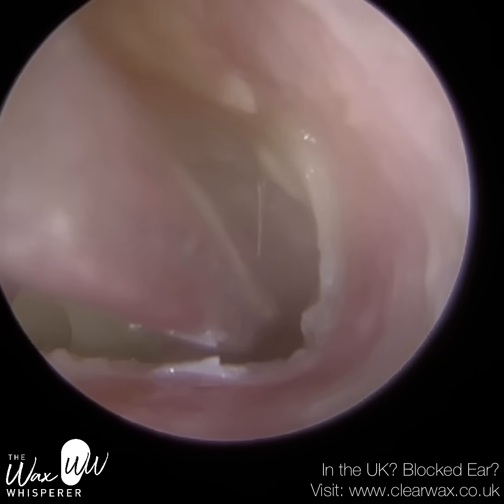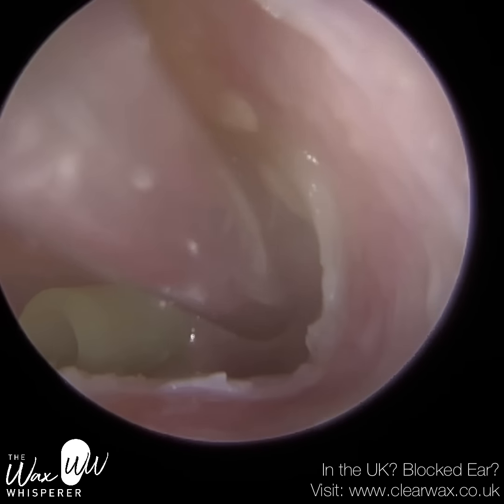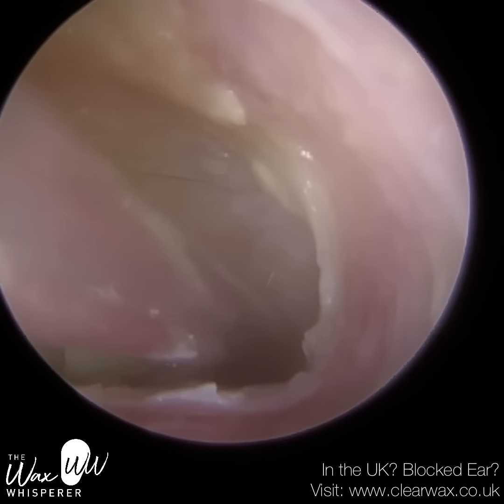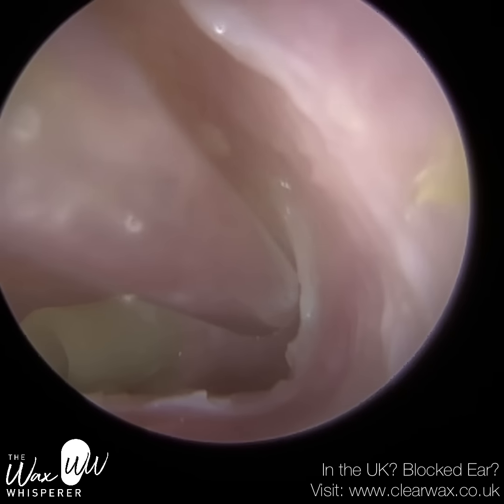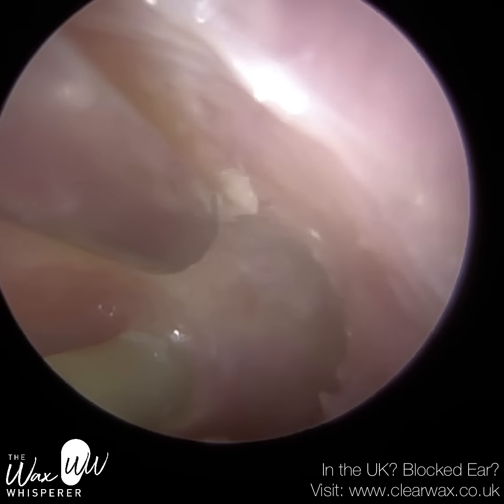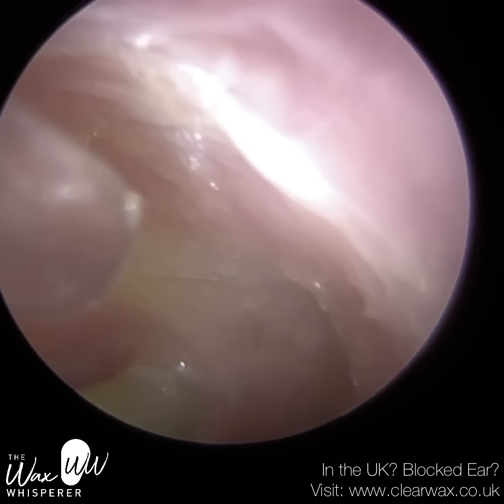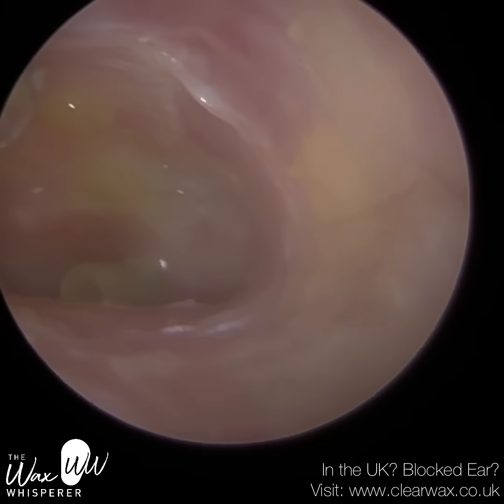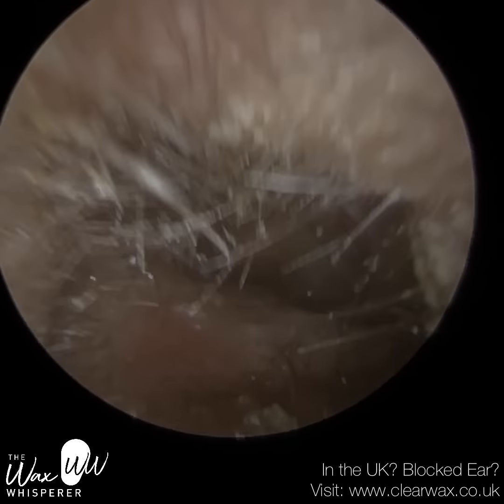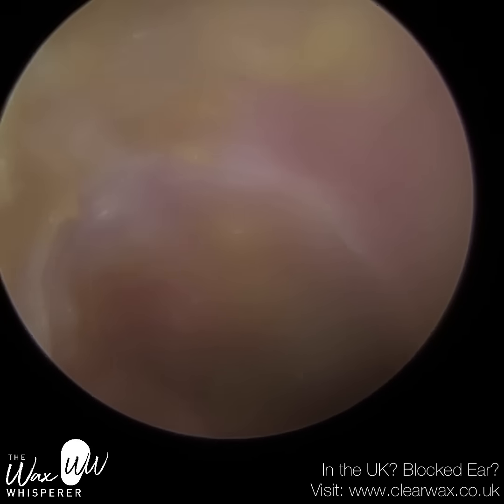So I'm going to just discuss the otitis externa first, and then I'll go on to the T-tube and explain why in combination it's a bit problematic for the patient. So they have this really dry skin that develops every month, and not only does it line the ear canal, but it is also adhered to the eardrum, and it makes the patient's ear extremely itchy.